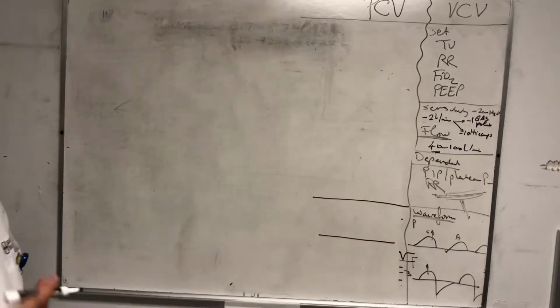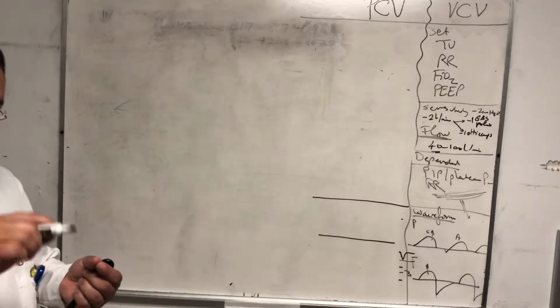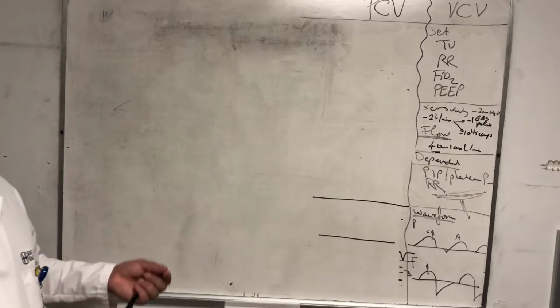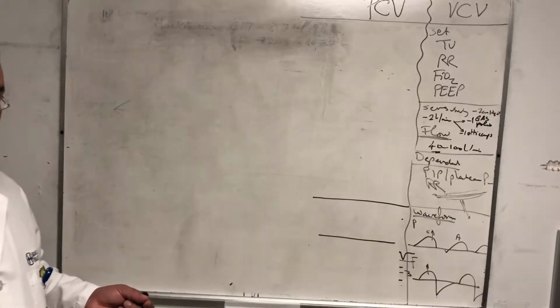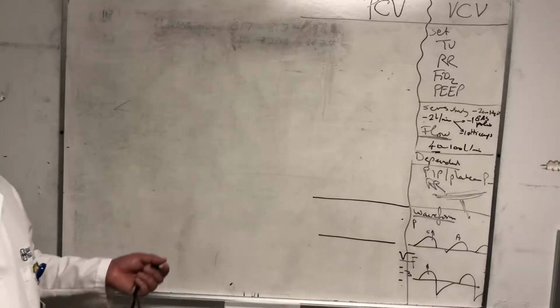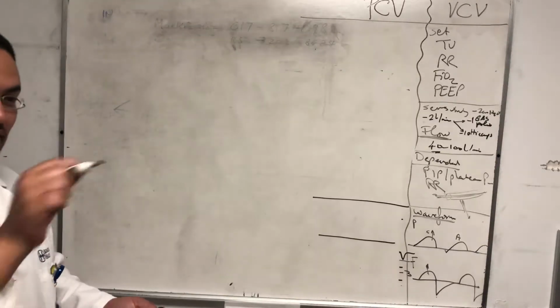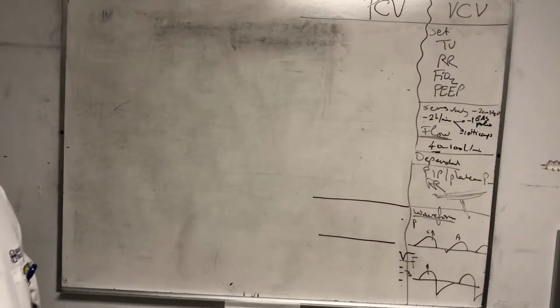Because not every hospital has people who do it manually. You have to build in a system, in an order system, that has the 5 set parameters, for example, for every mode. So when you enter orders, you can't get out of the orders until you fill all the 5 set parameters. They're all asterisks, for example, right? If you don't put the asterisks, people are not going to write it. Example, our BiPAP order doesn't have asterisks on the IPAP and the EPAP, and people don't fill it all the time. This is human nature.